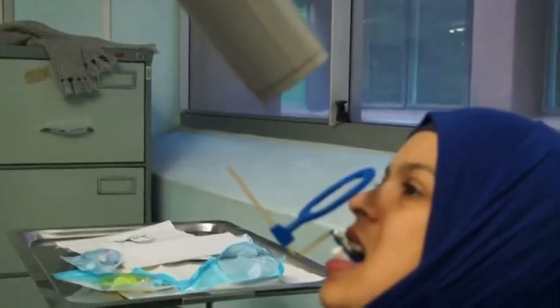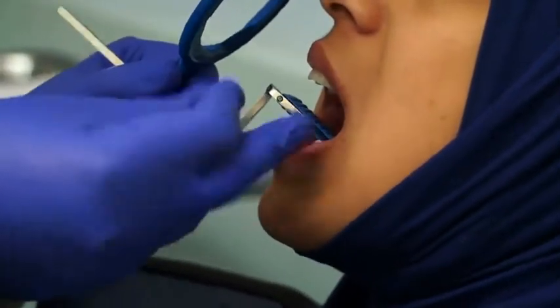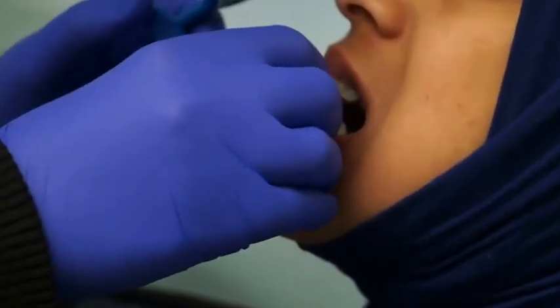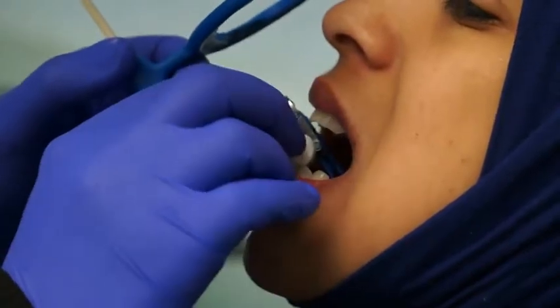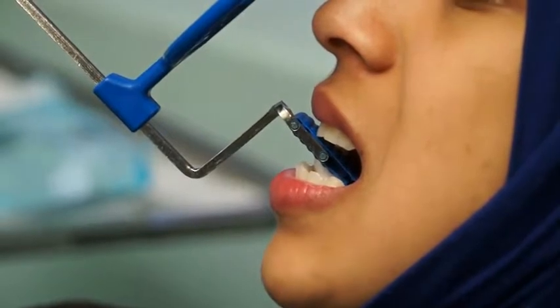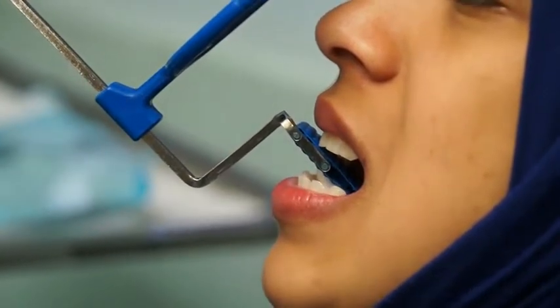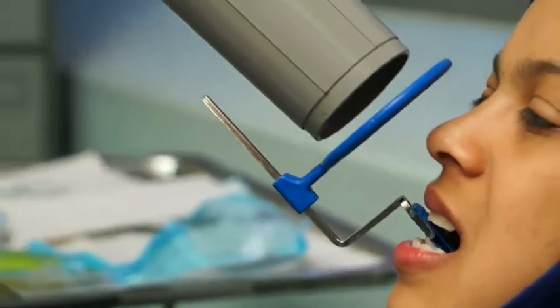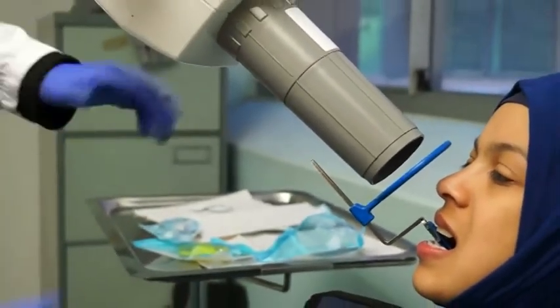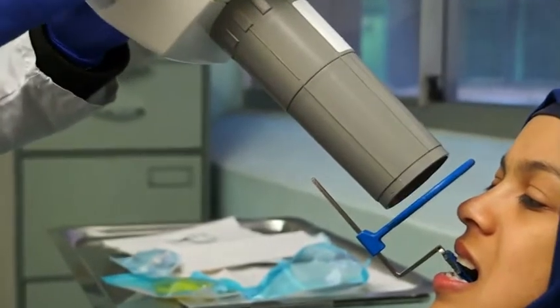That covers the two central incisors. If we want to do the lateral incisor, the film position is the same — the only difference is that we make sure the lateral is centered on the film. Your patient can be in any comfortable position as long as your central ray is perpendicular to your film and your film is parallel to the long axis of the tooth, because you have your run holder to guide you. The same applies when doing the canine — get the canine centered on the film, and the cone is parallel to the indicator so the central ray is perpendicular.